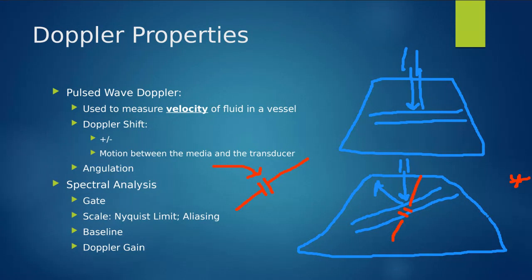That's just how the control came on when we hit pulse wave Doppler. We would want to turn that so that it looks like this and fits in our vessel. Or we can heel toe our vessel to match the angulation of our gate. Either way, our gate should match the angulation of the vessel being sampled on the screen. That's how we are going to get accurate velocities.